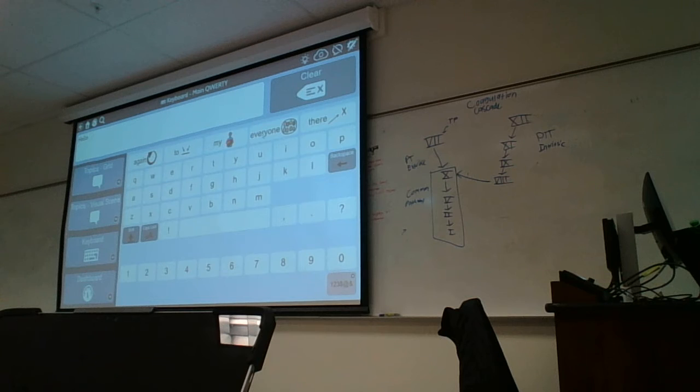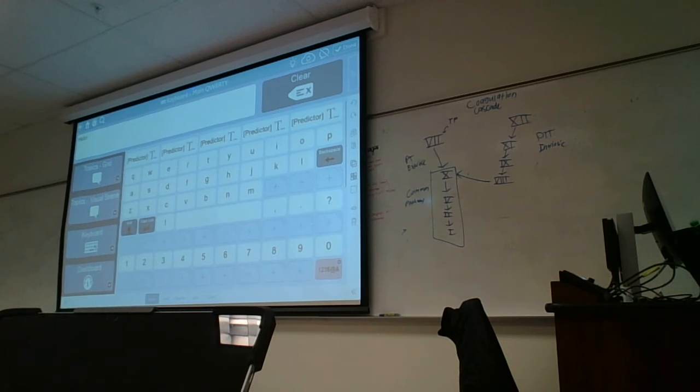There's also the option to put ABC keyboards on here. There's keyboards that are bigger that you can use, so it depends on what your client's needs are. If there's any visual acuity issues, you can also make adjustments to that. That's the aphasia page set.